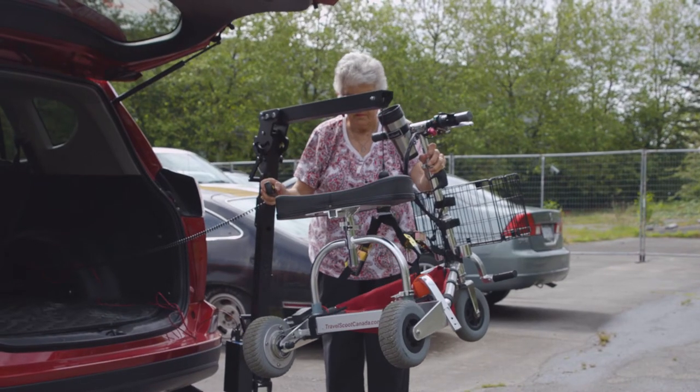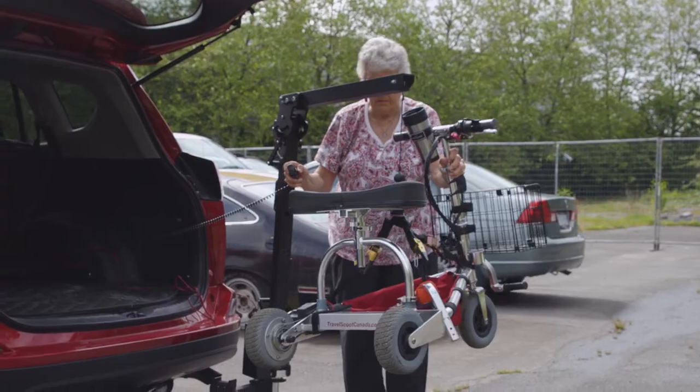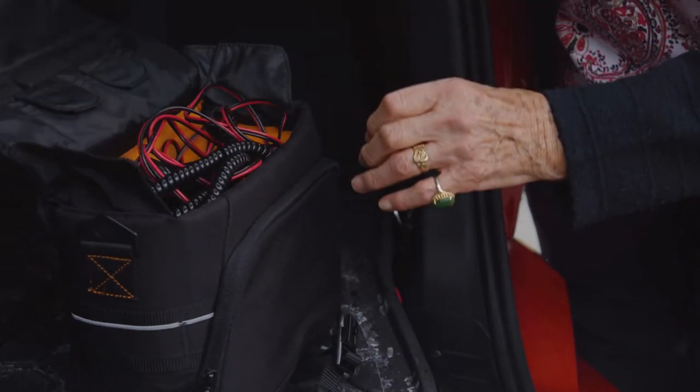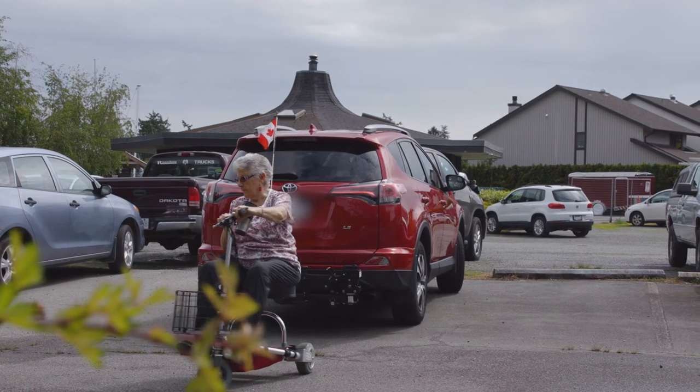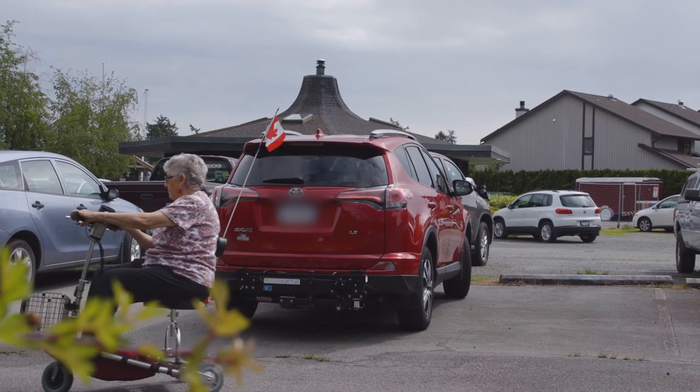Removing the mobility aid from the vehicle is just as easy. The Hitch Lift is powered by a rechargeable battery pack. The device is made with weather-resistant materials and remains folded on the outside of the vehicle when not in use.